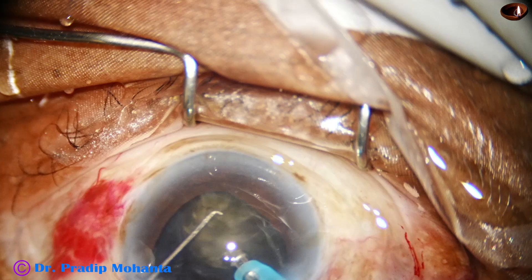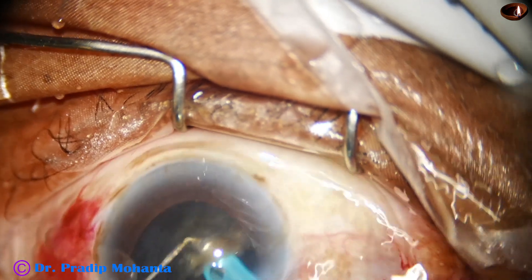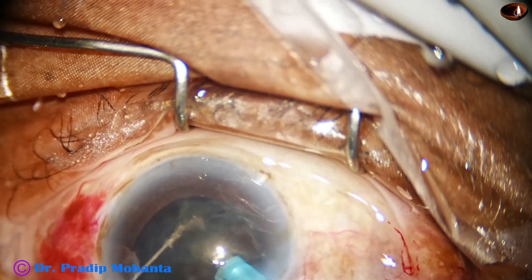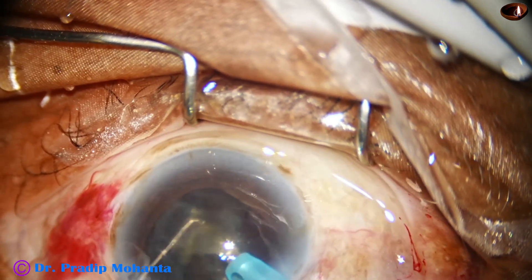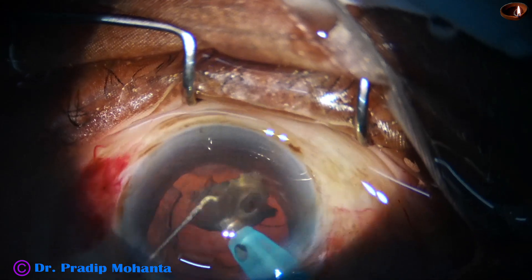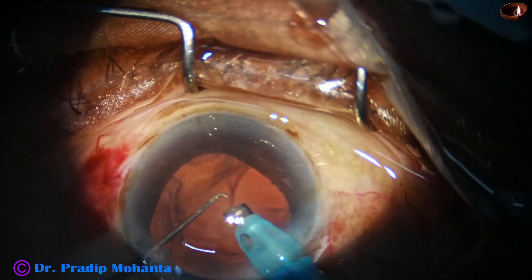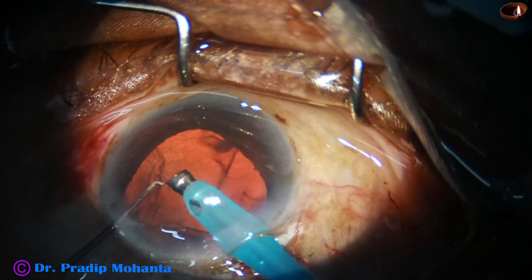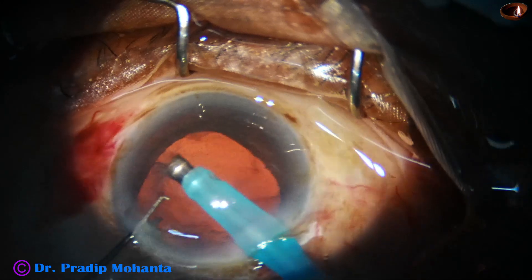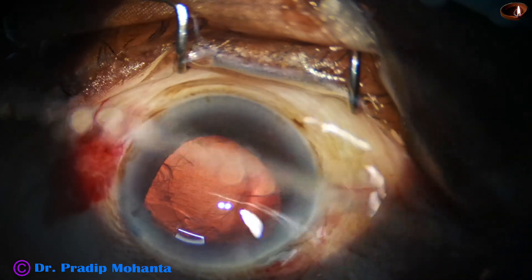The energy is being used very judiciously so there is no wound burn. We allow some leakage of fluid through the main wound so that the wound remains cold. It is very important not to cause wound burn in phacoemulsification — wound burn means there is more chance of leakage and sometimes we have to put sutures. So we must prevent wound burn, prevent posterior capsular rent, prevent iris injury. And probably the most important thing is we must protect the corneal endothelium — always stay away from the cornea, hold the pieces, come to the center, be at the iris plane and emulsify.